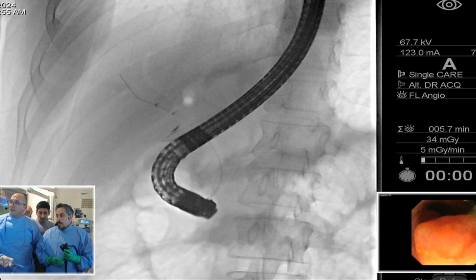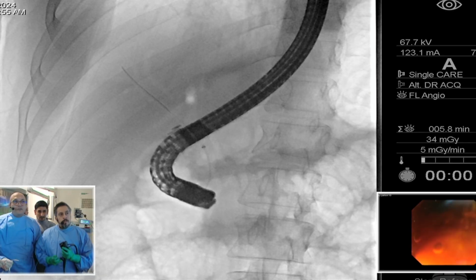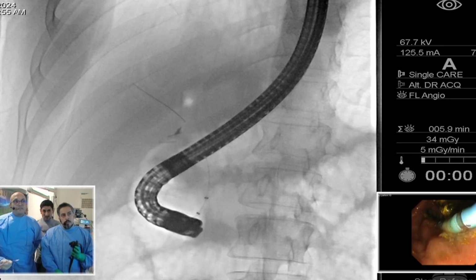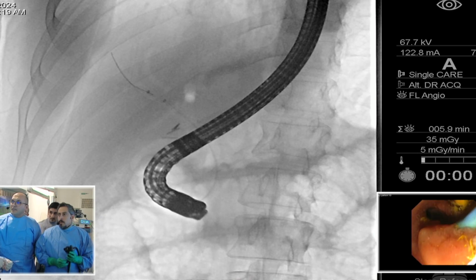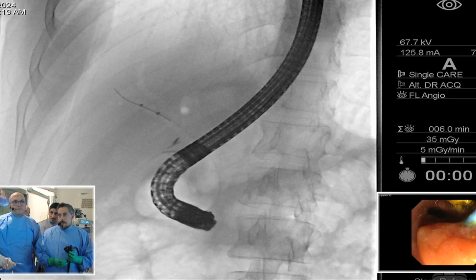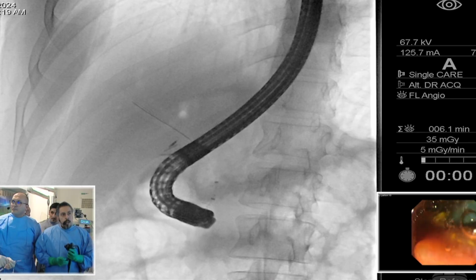So, last question from Mohammed. For this case, I think what Iyad said is very important: flushing both systems and making sure you remove all the nidus, the debris. Do you keep the stent for 3 months, or do you bring the patient in 2 or 4 weeks' time to remove the stent and to clear the duct?